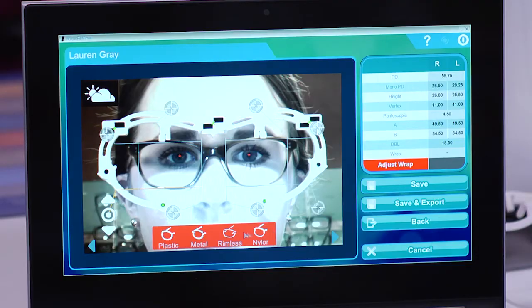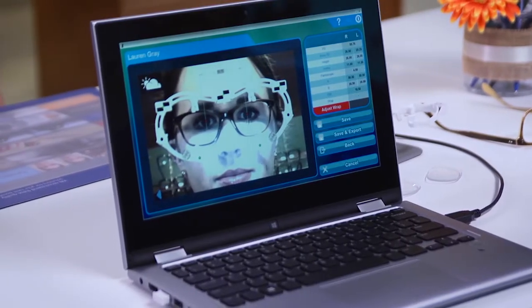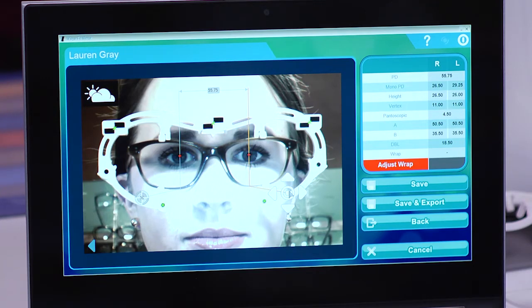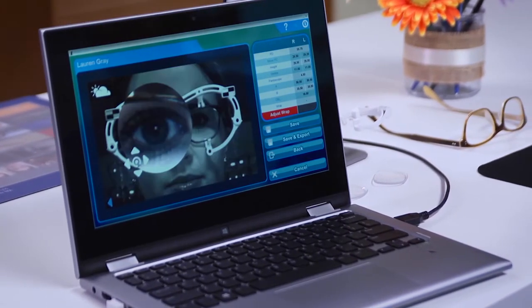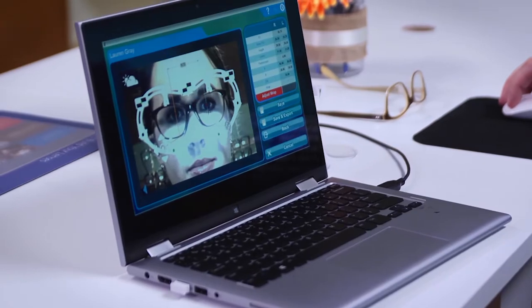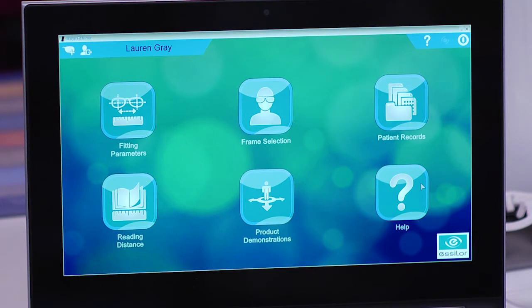Once you've completed this task, select the frame material and then click on the blue arrow icon to go on to the next screen. Now you need to check that the corneal reflections have been properly detected — they have reticular charts on top of them. Adjust each of the red crosses as needed by selecting the target icon twice to zoom in, then drag them or use the arrows to move them. When the corneal reflections have been properly detected, adjust the curve if necessary, or click on the save icon to save the measurements and return to the home page.